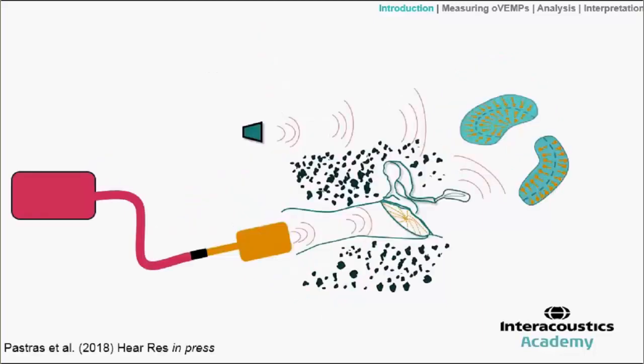And that just comes back to the effect of air conduction and bone conduction stimuli. So we might consider the possibility that these different modes of presentation could stimulate the utricle and of course the saccule too slightly differently, where with the AC presentation, as you see here, you might expect more of a transverse direction, whereas the BC stimulation is somewhat more complex, but with more of a lateral direction to the main thrust of vibration.